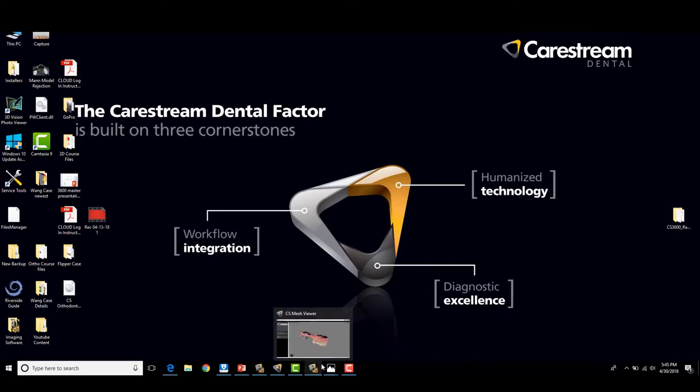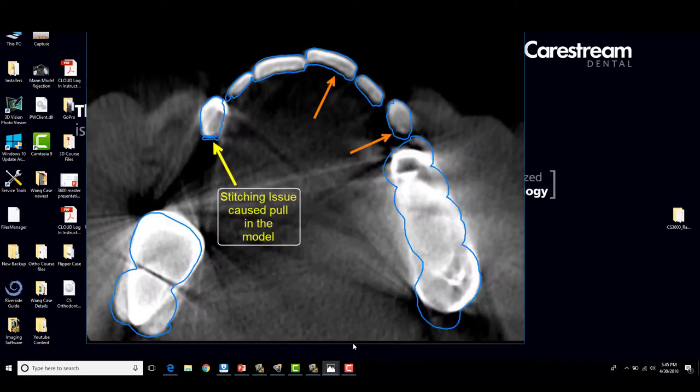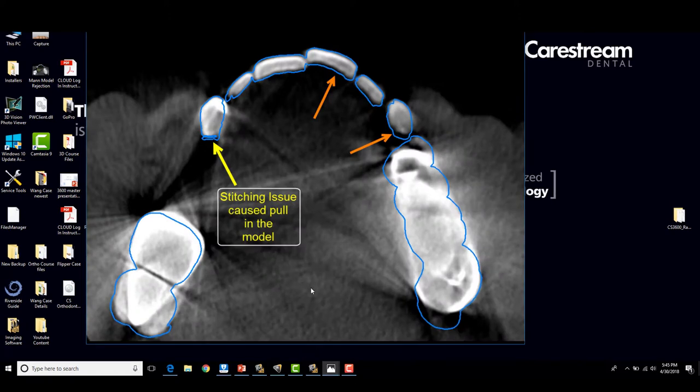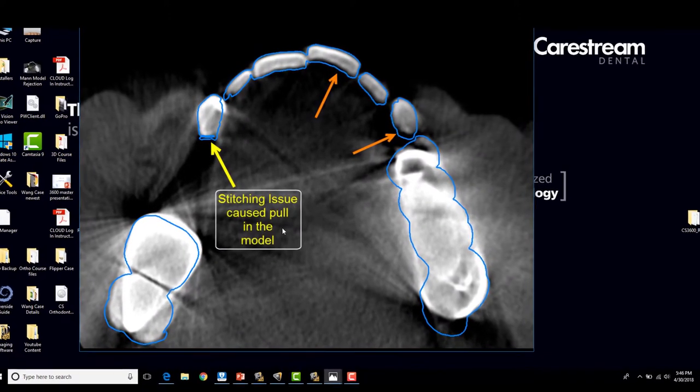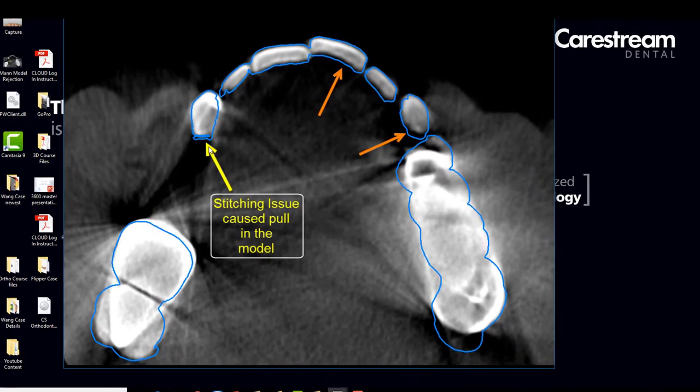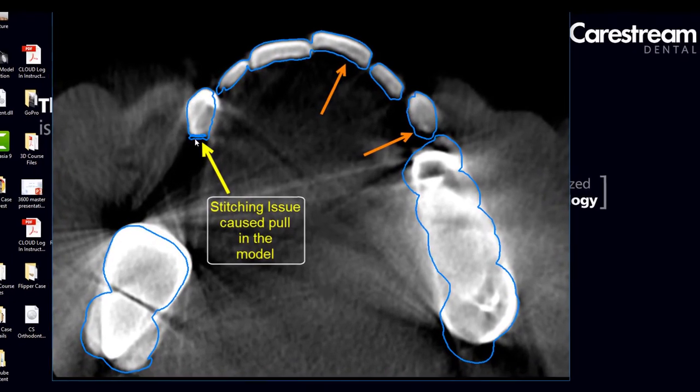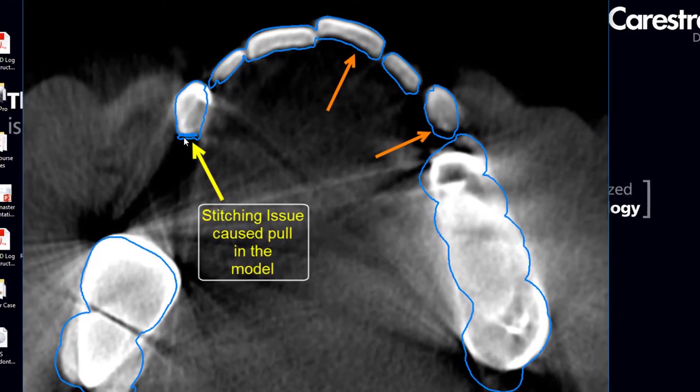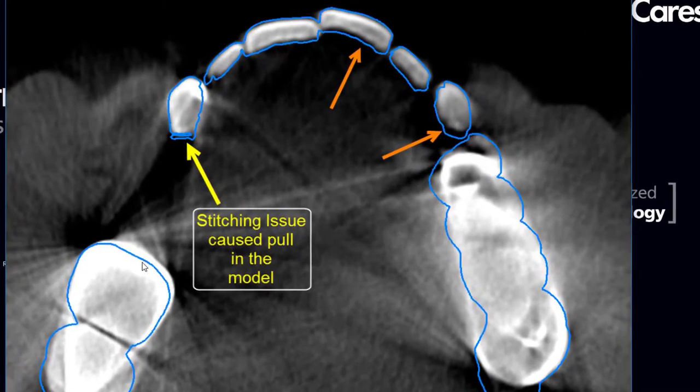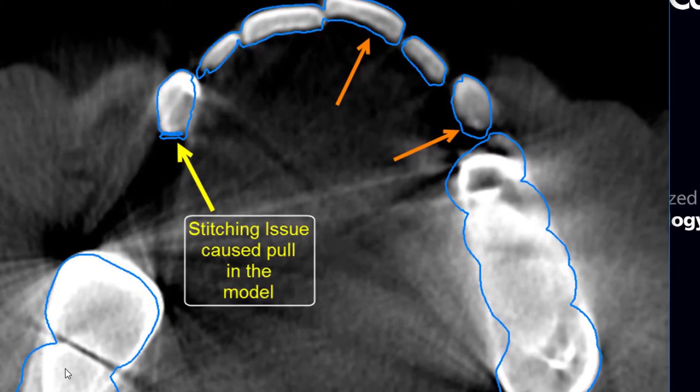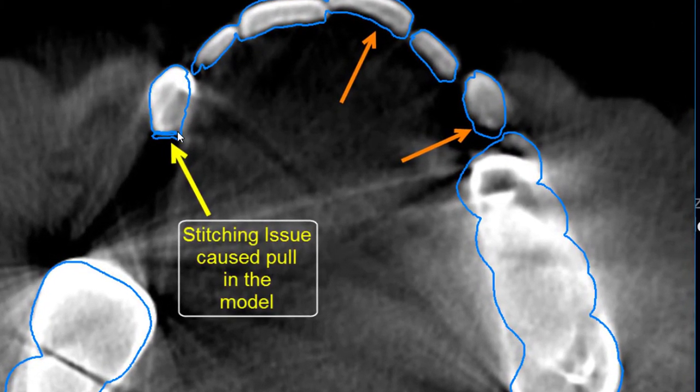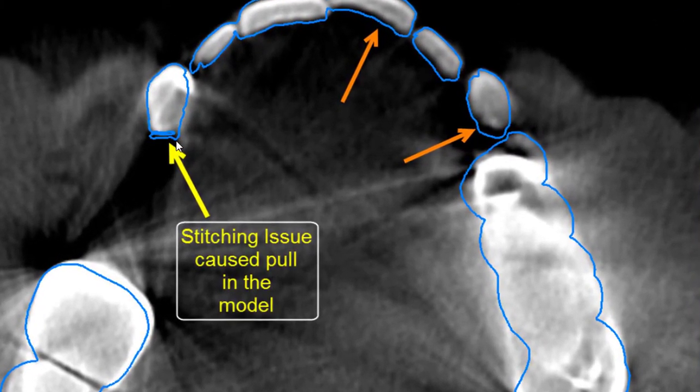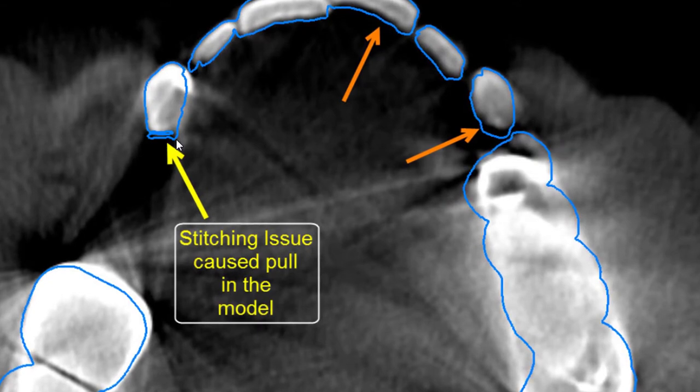Another case that was sent was this one. And you can see here, if we focus on this area over here, the stitching error that was happening from the scanner. The blue is the STL file and you can see how that blue is overlaid improperly for merging of those data sets.